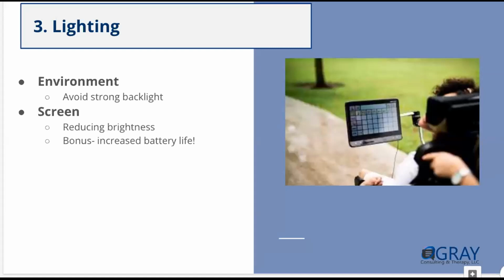All right, lighting. The newer cameras are all starting to be better at tolerating outdoor lighting. Previously, I would have told you it doesn't really work so great when you go outside. The way it picks you up is use of infrared light.